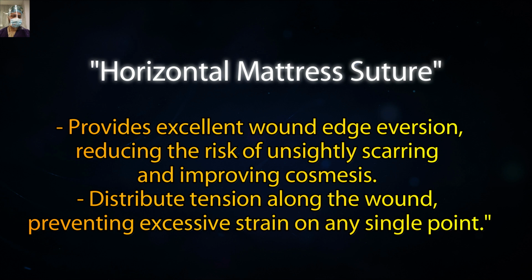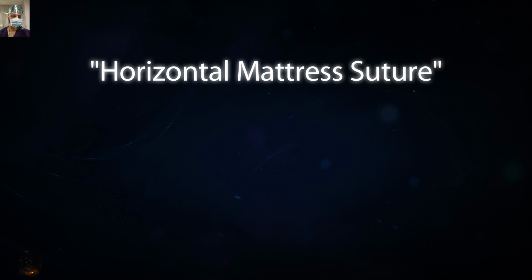Friends, as far as I am concerned, practically I have used the vertical mattress suture and the horizontal mattress suture only in cases where we wanted to achieve a hemostatic effect. So it gives a very good hemostatic effect. But if you check the literature, it is also a cosmetic suture and a faster way of closing as compared to the vertical mattress suture. But practically I feel, and you may have a different experience in your institution, that it is a lesser-used suture, used only in cases where you want the hemostatic effect.